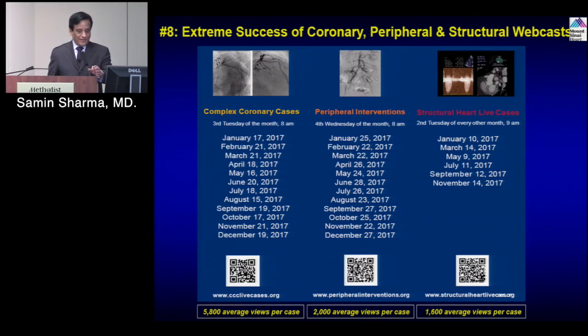Yeah, actually, I wanted to add one or two points on bifurcation and maybe CTO, but I said they would confuse the issue. I gave a lot of data. One thing we have learned, and I can sum this up, is that 5-10 years ago we said all cases should be a crossover or conventional one-stent strategy. What data have accumulated now over the years is that with a mini crush, with a DK crush, and some culotte done correctly, there are lesions where two stents will be better than one. So the answer is not that you do one stent or two stents. The answer now is to identify the lesion which will do better with two stents.